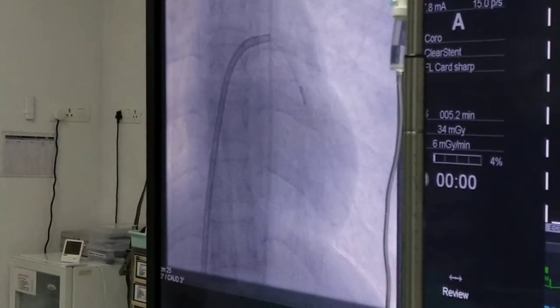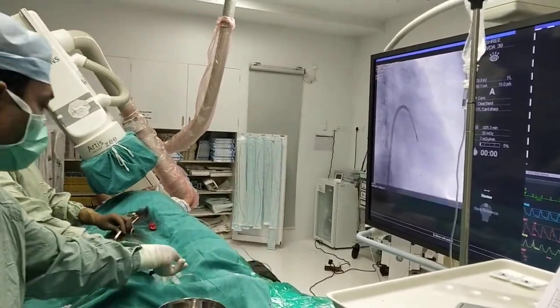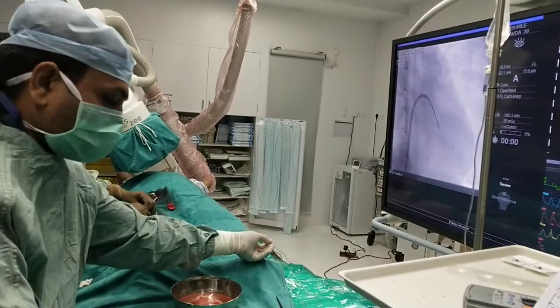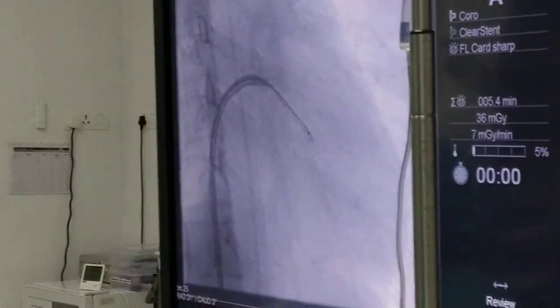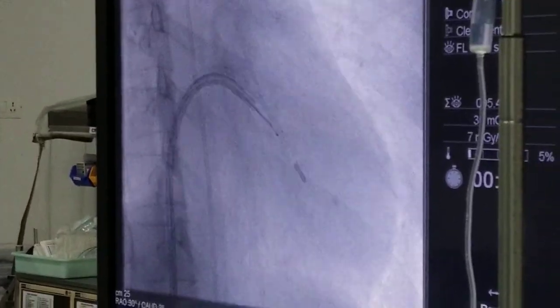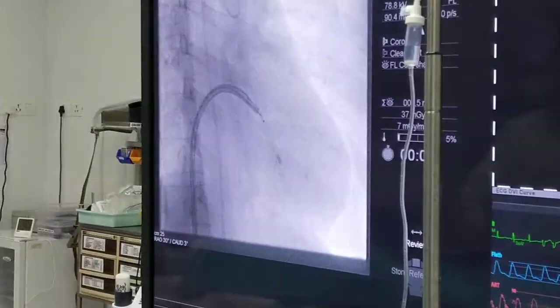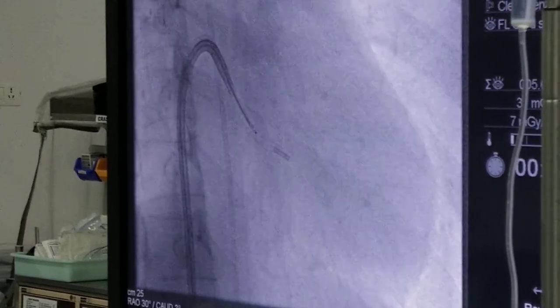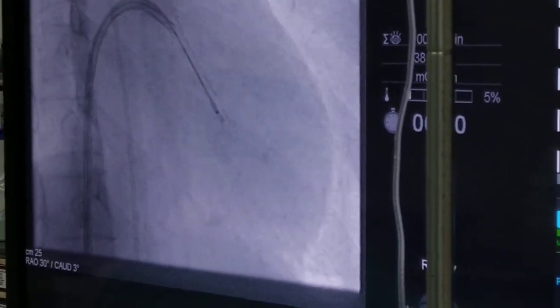The best way to cross the mitral valve is in the RAO-30 position. Make it RAO-30, make the balloon negative, and with each beat during diastole I will try to push the balloon inside. I am already in — I will try to go up to the apex. It is not in a proper position; it may go through the body of the ventricle. So I will try to wrap it properly and push it to a correct position.